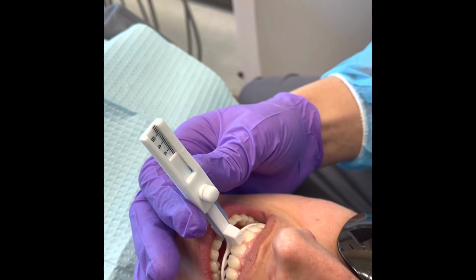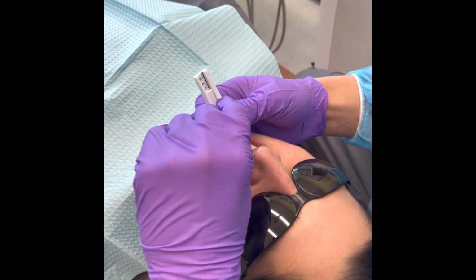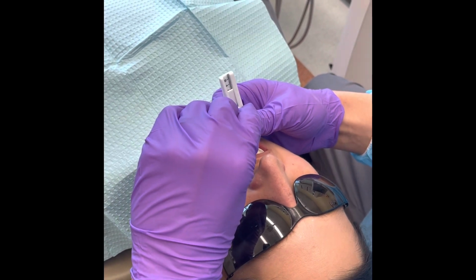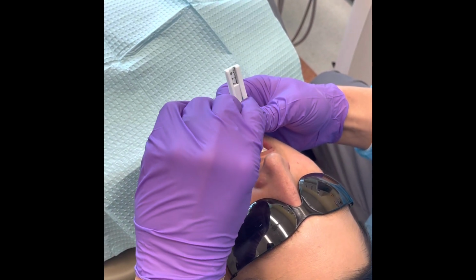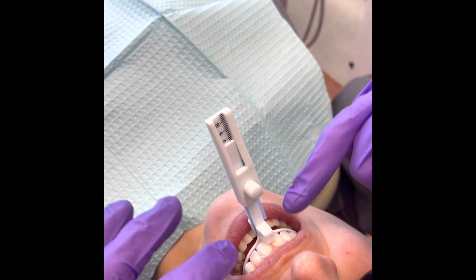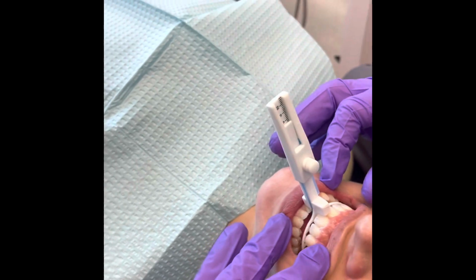We know we want to be somewhere around 50 to 60% max protrusion. So go ahead and slide your jaw ever so slightly forward for me, and I'll tell you when to stop. Stop right there. Perfect. All right, so that should put us somewhere around 50%. And when you look from the side, she's pretty much edge to edge.